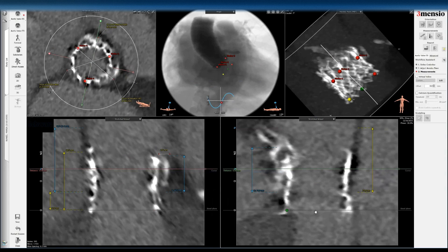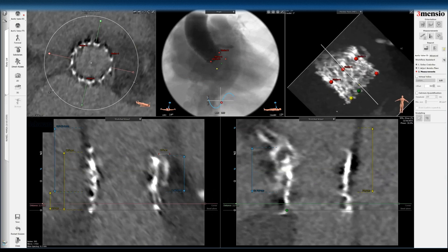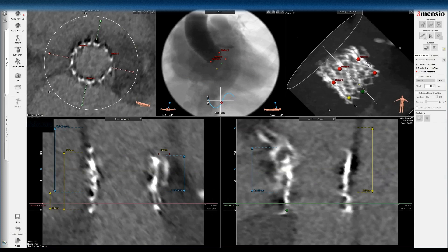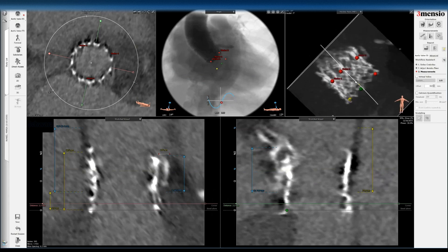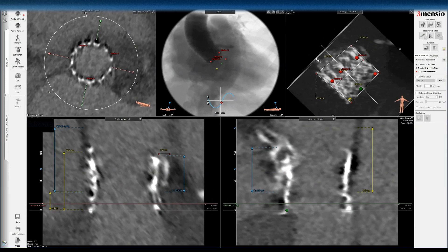Now let's look at the valve frame itself. Unfortunately there's some artifact with this device, making it harder to measure precisely. But you can drop the gain to see the frame metal better, and you can see how one side of the valve is taller than the other. This is a free-cut view. On fluoroscopy you will see this very clearly. I measure the inflow and the height of that side using approximately the center of the frame rather than the outer frame.